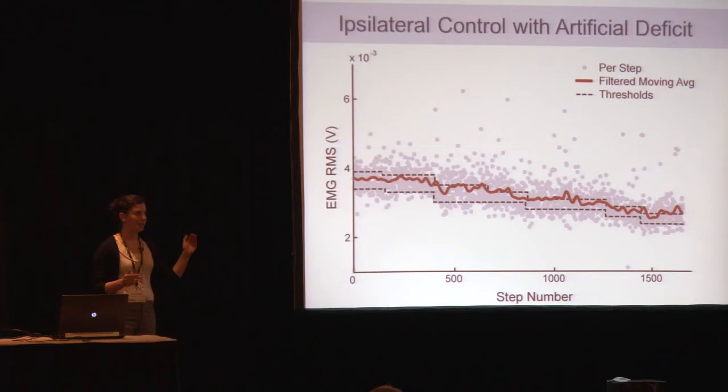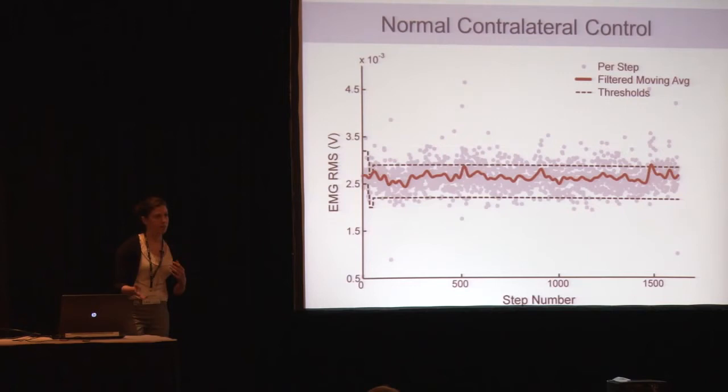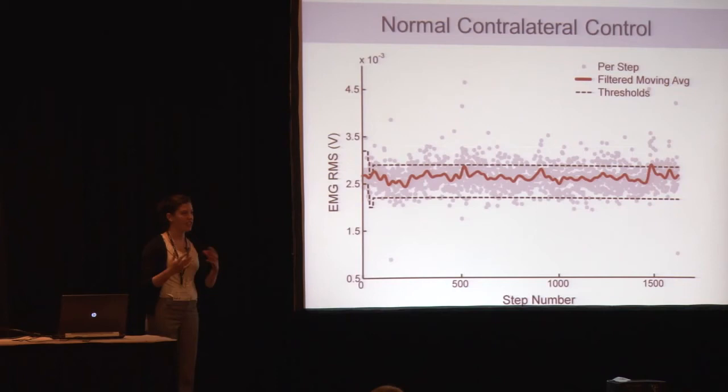Preliminary metabolics data suggest that the variation in assistance that the device is capable of providing may not be as great as we were anticipating. So the subject may be just utilizing the assistance of the device rather than trying to increase their muscle activity to get to that maximum level of assistance, which isn't quite different from the minimum. For comparison, we also did some studies where we used the left soleus muscle to control the assistance given to the right leg. And over time, there was not really a general trend seen in the change in muscle activity.